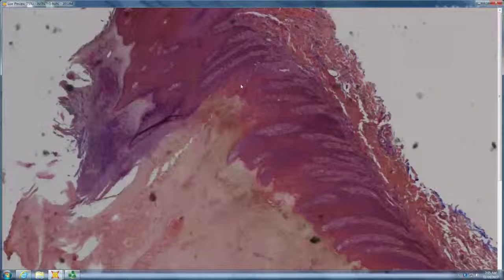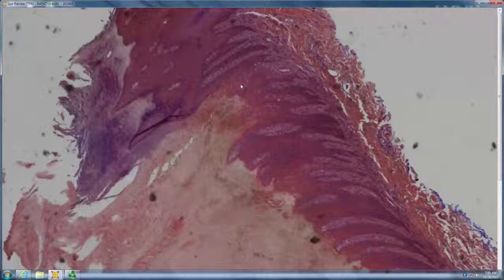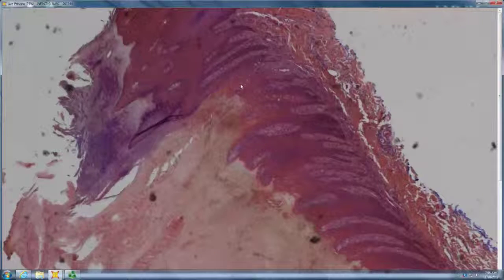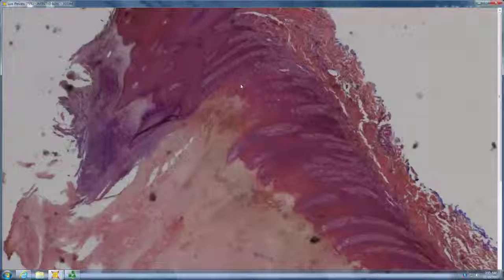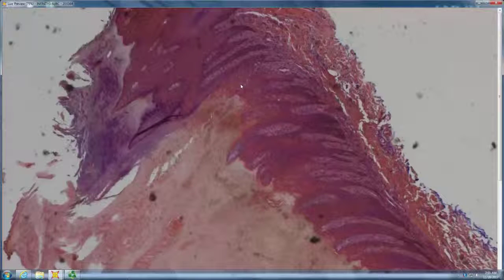Anyone? Poro. And remember, center of poro can look like anything. Center of poro can have hyperkeratosis, can be atrophic, can be lichenoid, psoriasiform. So always look at the edges for the cornoid lamella. So porokeratosis, that was a tough one. You did fine.